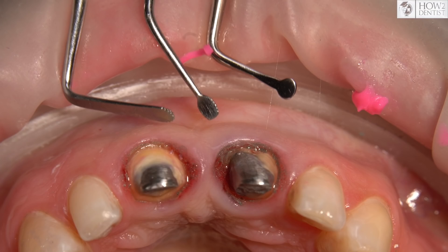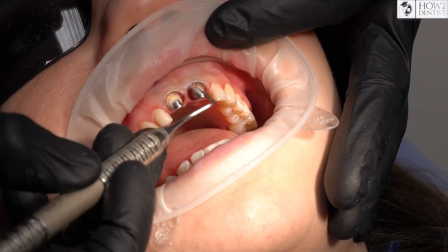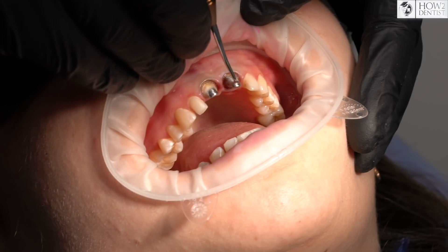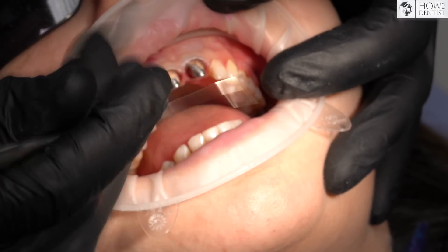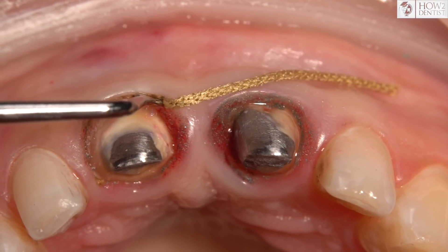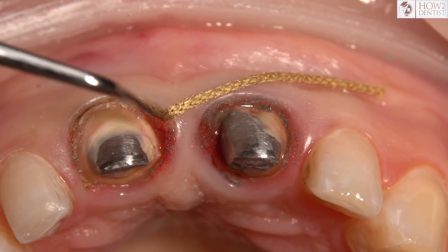The working part must be very thin, which unfortunately some producers do not understand. The handle and working part of each packer are at different angles to provide access to various groups of teeth. It is preferable to place the packer in the frontal area so that the arm is from the side rather than in front of the patient's eyes or chin. Movement of the working part along the tooth should be strictly parallel to the root — at other angles the cord will spring on the gum, will not pack into the sulcus, or there will be a periodontal injury.